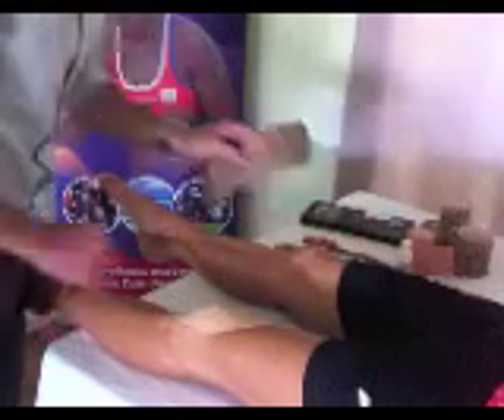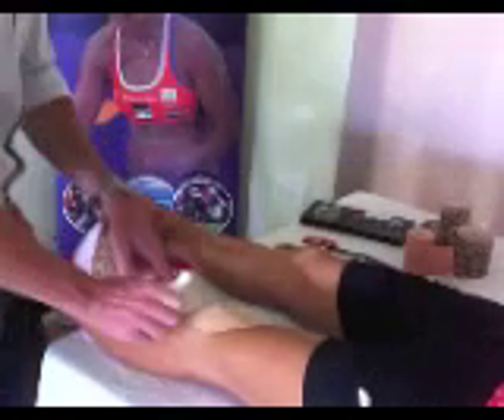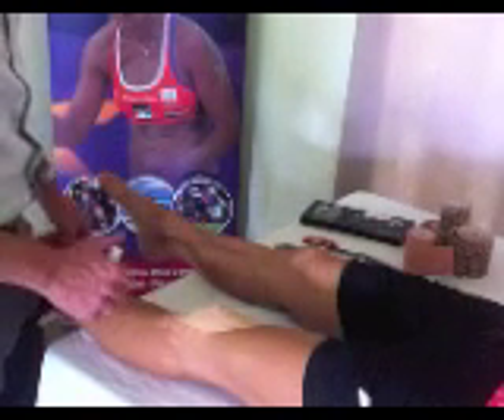Because of the increased strength of these power bands, they're generally recommended for short duration wear time — several hours, a training session, perhaps up to half a day or so. If you're leaving it on longer you certainly can, but you need to take great care not to apply very much tension. The position itself is going to create the tension as they bend — that's where our tension is. You can see how that's going to hook in under the lateral aspect of the patella.